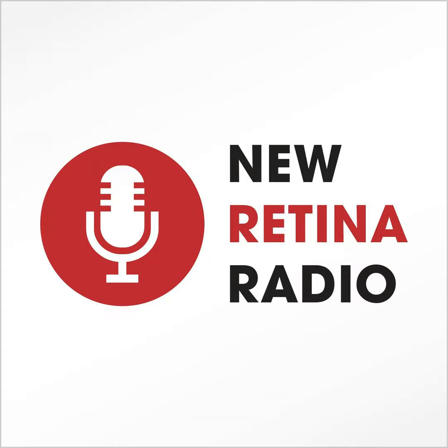Great. So, clearly in clinic, we have OCT devices that can acquire images much quicker. This one was at 20,000 hertz. We've got devices that are 80, 90, 100,000 hertz. So we can get those dense scans very quickly. But the advantage with home OCT is we potentially could get more time points, right? And so, Lediana, I'm going to ask you, is that a worthy trade-off if we exchange the higher resolution and higher volumetric data for getting more time points? Instead of a snapshot once a month, every 2 months, now we're getting them every week or every couple of days. How's that going to change things?